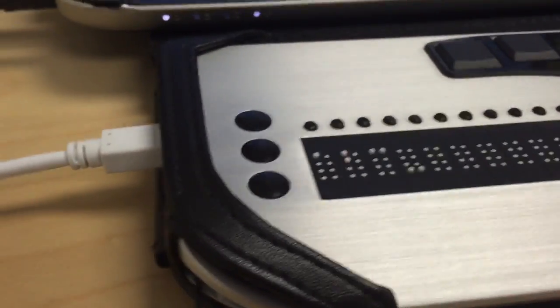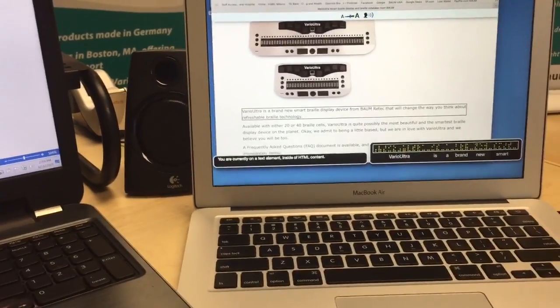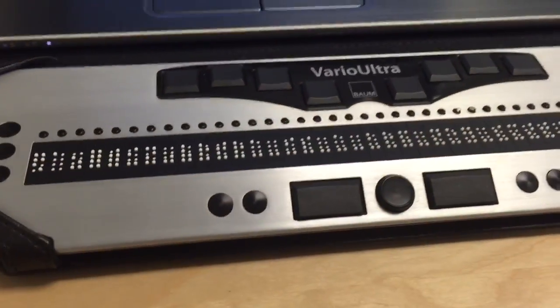Nothing has changed. And as soon as I've done that, I can flip my switch to go back to braille display mode. When I do, it automatically connects back to the last thing I was using, which in this case was the MacBook. Very sweet indeed.